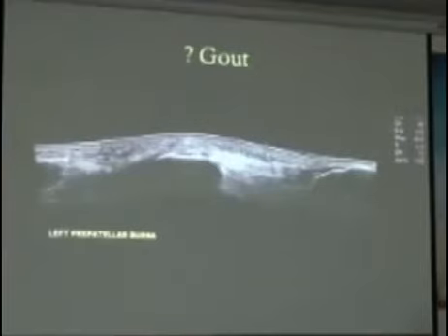So this was an interesting case that I had only last week, and it's a patient who presented with a very painful, red, hot prepatellar bursa. This patient was a pilot, and he was doing some flight simulation in a simulator, and he knelt down on the ground. He had no injury apart from that.